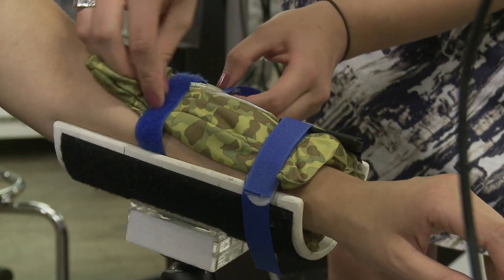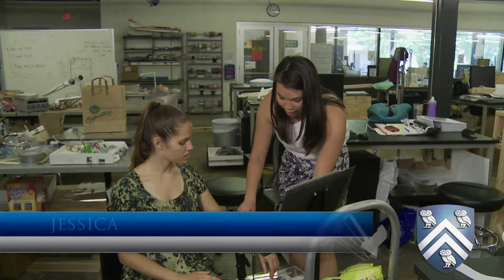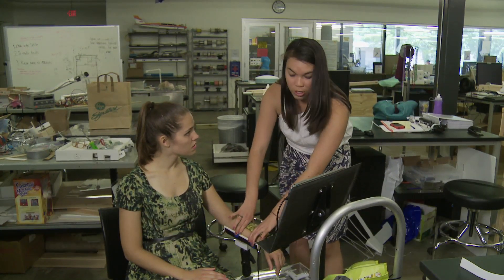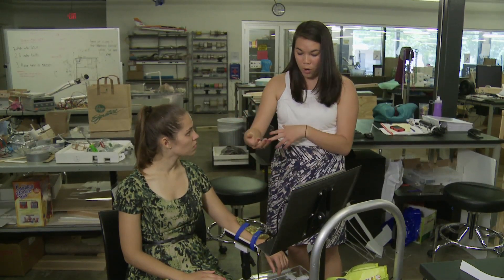The first step is adjusting the arm restraint to match the patient's physiology. We have vacuum bags filled with couscous, and when we vacuum the air out and velcro the patient's arm, it's restrained enough so the patient can't lift their arm or twist it.